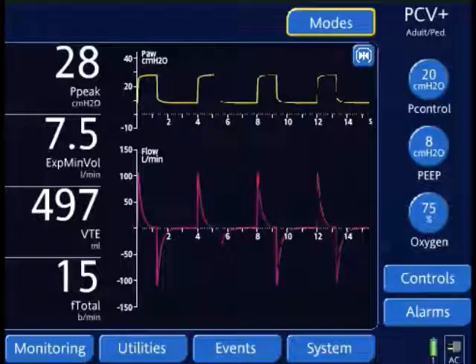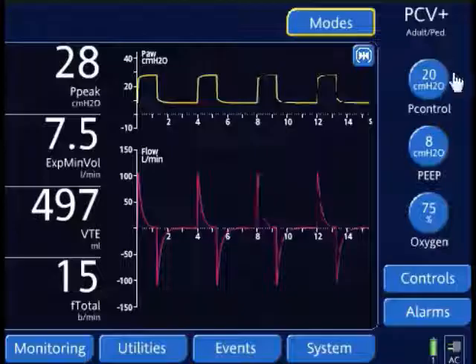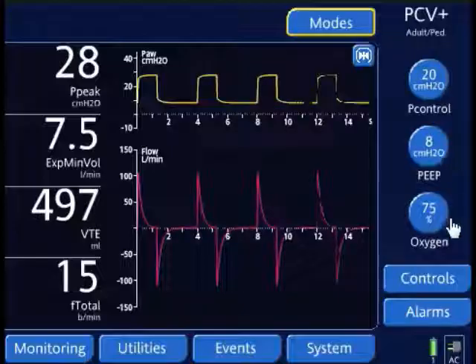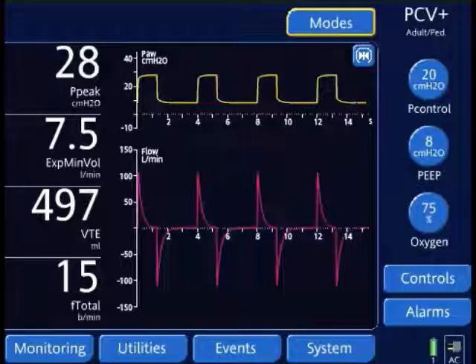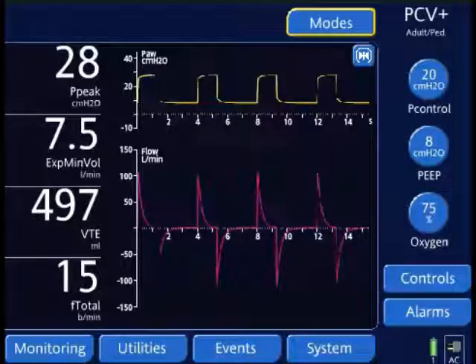The patient is currently in pressure control ventilation with a pressure control at 20, PEEP of 8, and 75% oxygen. Based on the other presentations I gave, I'm going to go over the settings.